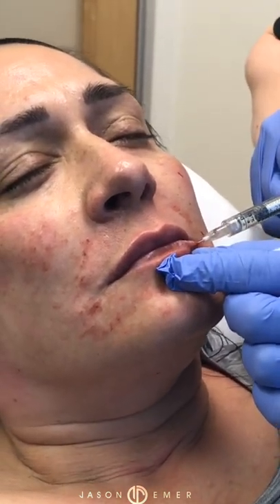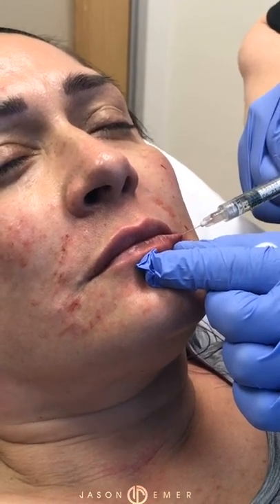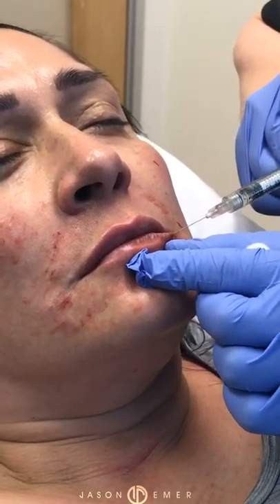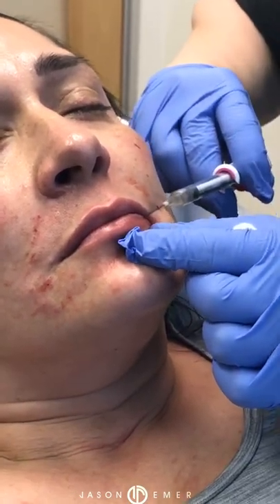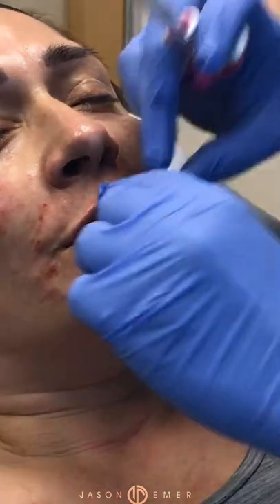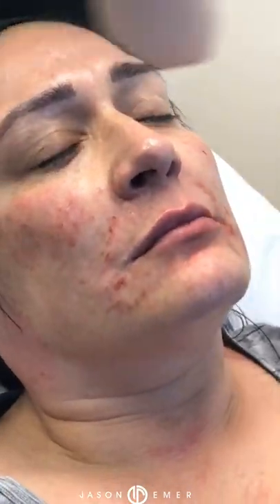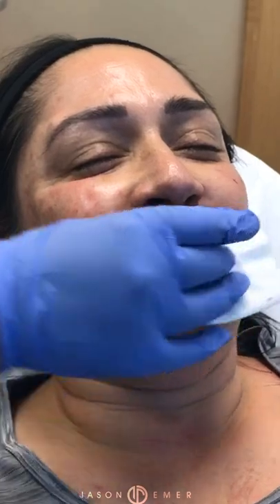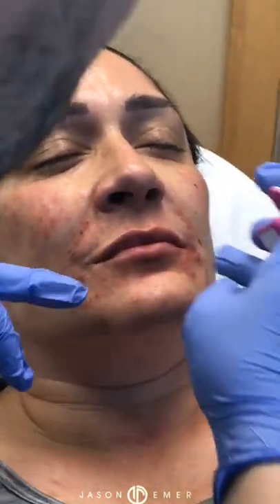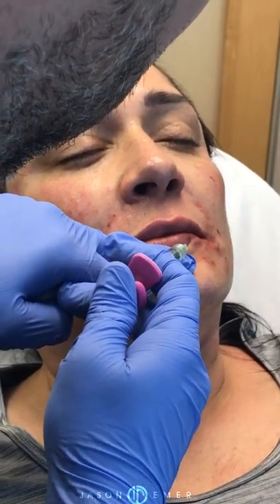Now with her, I don't want the whole lower part of her lip, the whole elongation. So I'm going to go about 3/4 of the way and save just a subtle bit, because there's not much in the Volbella. She can ice again in between. I'm almost there. A little bit, you can see, nice and balanced. There's just a little bit of volume that's needed right here, so a little pinch right there.